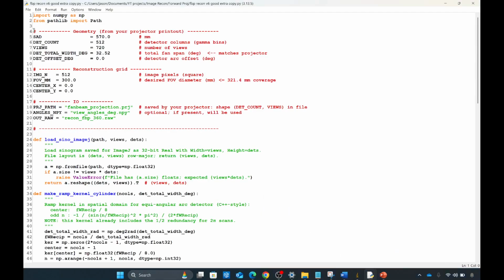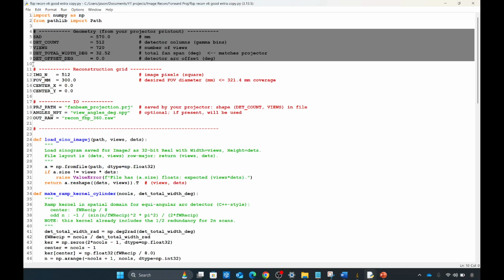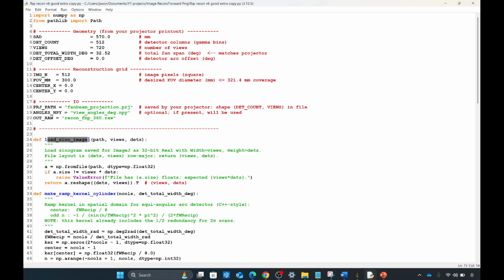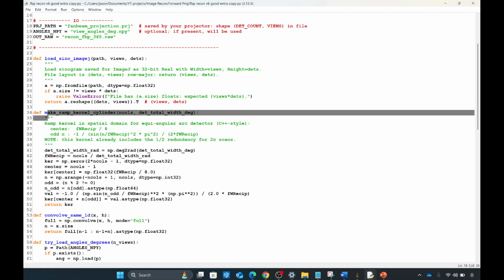And here you can see we first set up the geometries exactly the same as when we generated the projection data. And here is our reconstruction matrix. We set the pixel size to be 512 by 512. We load our projection from the projection file we previously generated. And we apply the Ram-Lak filter.